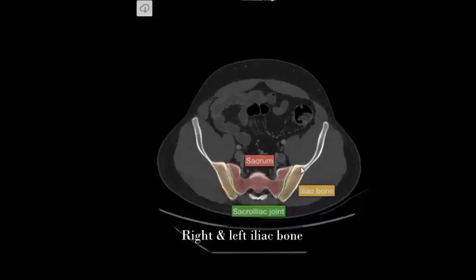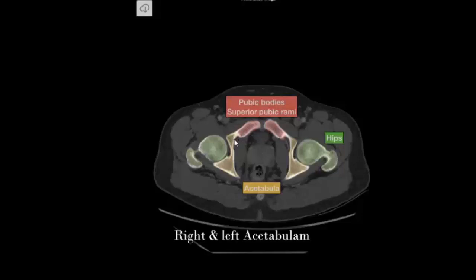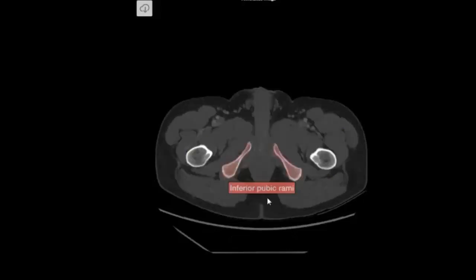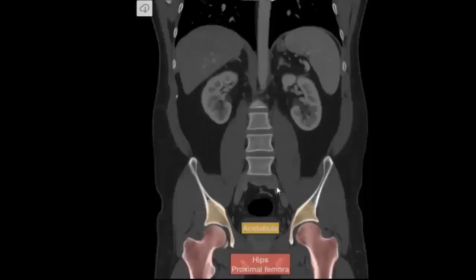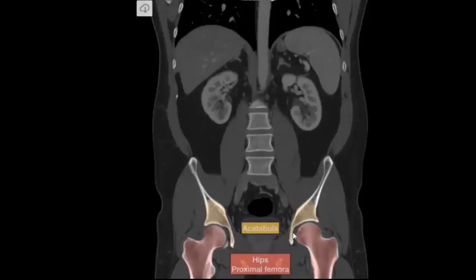Right and left iliac bone, right and left acetabulum, right and left hips, right and left acetabulum, right and left proximal femoral hips.